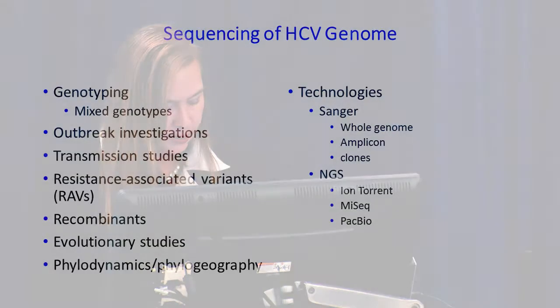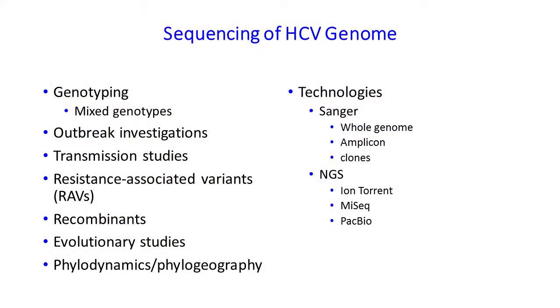Today, in order to get an idea about the minor population variants, we can use next-generation sequencing. This has simplified the process such that you create libraries of amplicons or libraries covering the entire genome. Whole genome sequencing provides variable coverage over the entire genome such that you could have 2 times coverage over certain genes and 100 times coverage over more conserved parts of the gene.